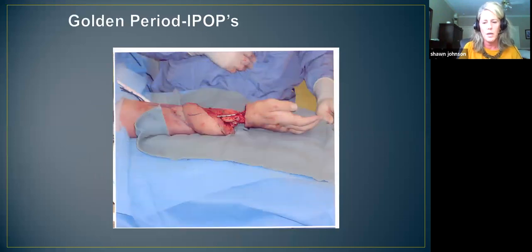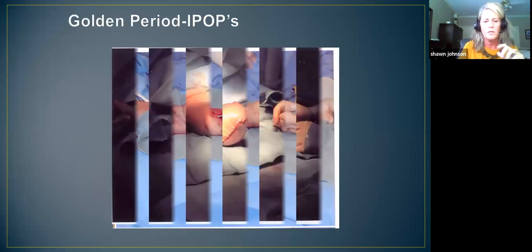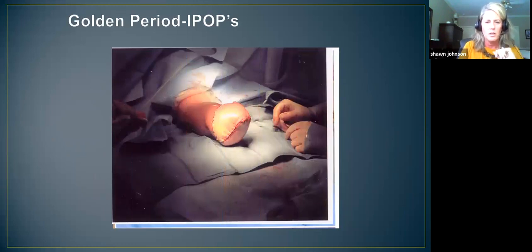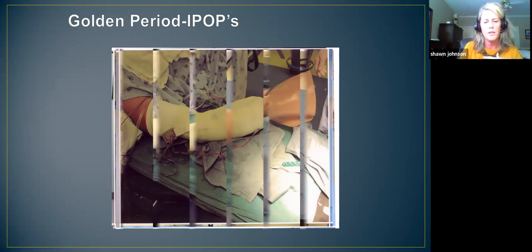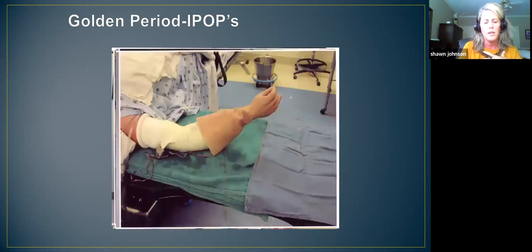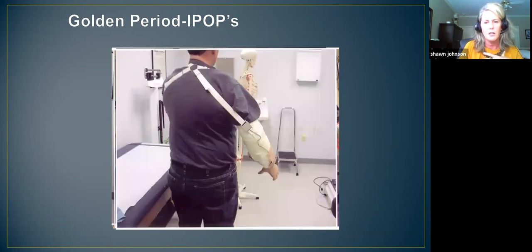I just want to show an example of someone in the operating room getting their hand removed, and then flaps, sutures, and after everything's sutured up, putting some sort of stockinette over it, and then a bivalve cast, hooking up a switch to a myoelectric hand, so that this person then wakes up in the recovery room with a prosthetic arm on. And then here, a few days later in the prosthetist's office, practicing with their prosthesis.